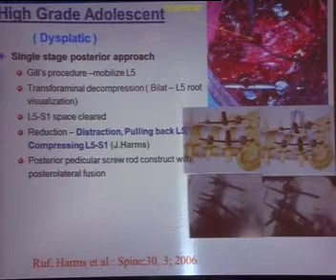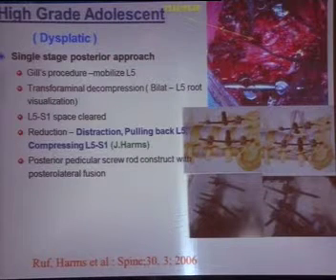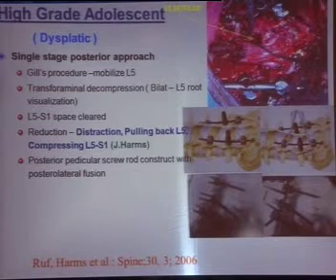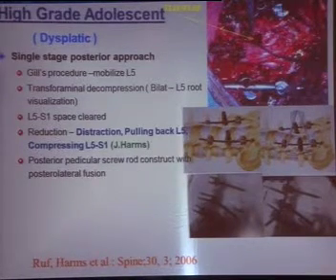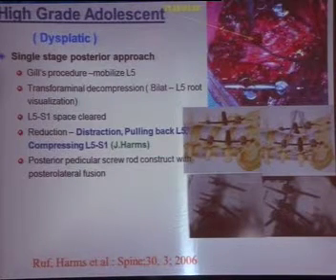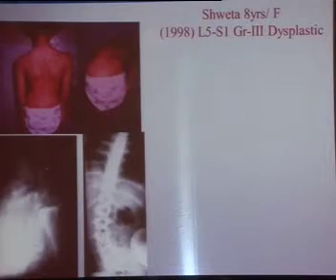That is done by various reduction devices, that is reduction screws or the tall Eiffel towers, to reduce it whichever way you want. But the crux of this is that the two nerve roots should always be visible to you. L5 monitoring should be done, and you should reduce it very, very gradually, and then you'll be relatively safer.